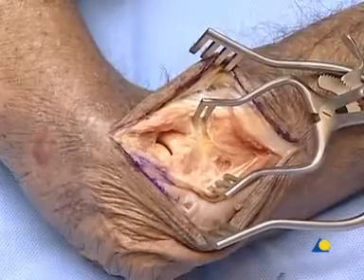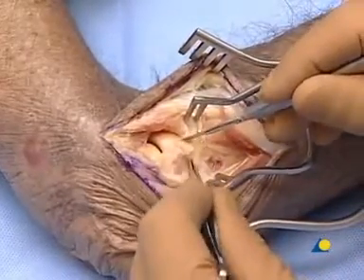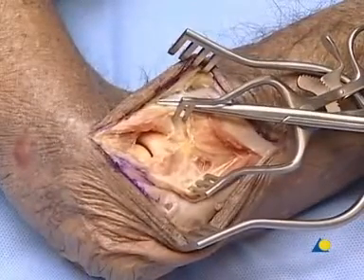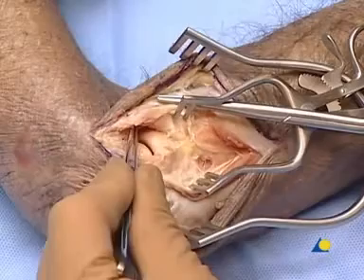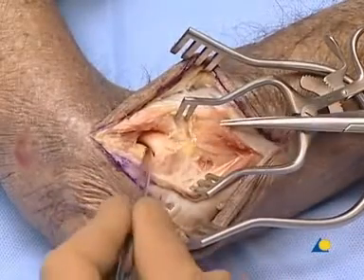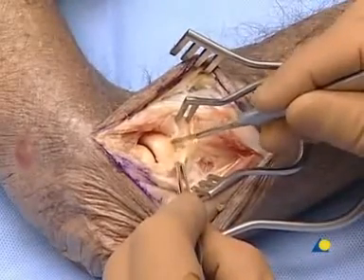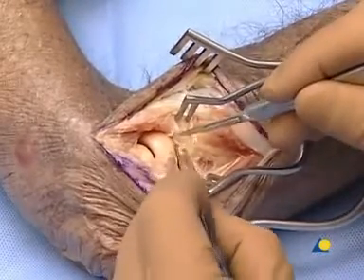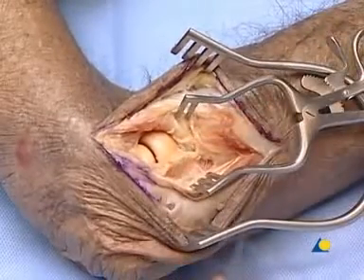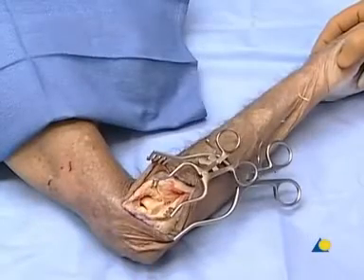The dissection should be extended distally to give access to the radial neck. The posterior interosseous nerve runs approximately here — it is located in the anterior capsule, which should remain undisturbed, and comes down the radial neck approximately 3.5 cm from the radial head. The capsule can be safely incised to the base of the radial neck. For added protection, the forearm is pronated, taking the posterior interosseous nerve farther away.